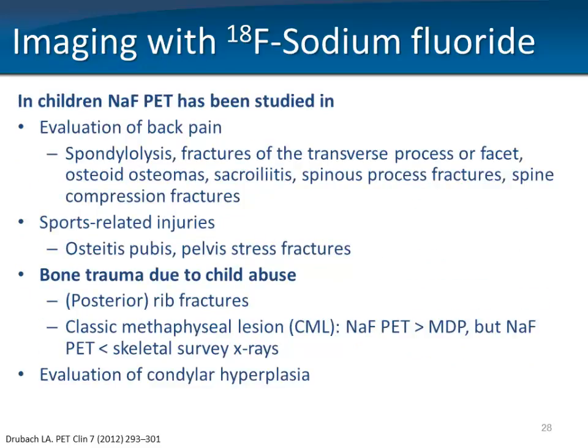So again, if I look in literature, trying to find real indications where you should do fluoride PET-CT instead of bone scan, what struck me is that it has been used in many indications. For example, the evaluation of back pain, sports-related injuries, and evaluation of condylar hyperplasia. However, when I considered these, I was not really sure whether these are things that you could not demonstrate using MDP, so I'm not really sure how absolute these indications are.